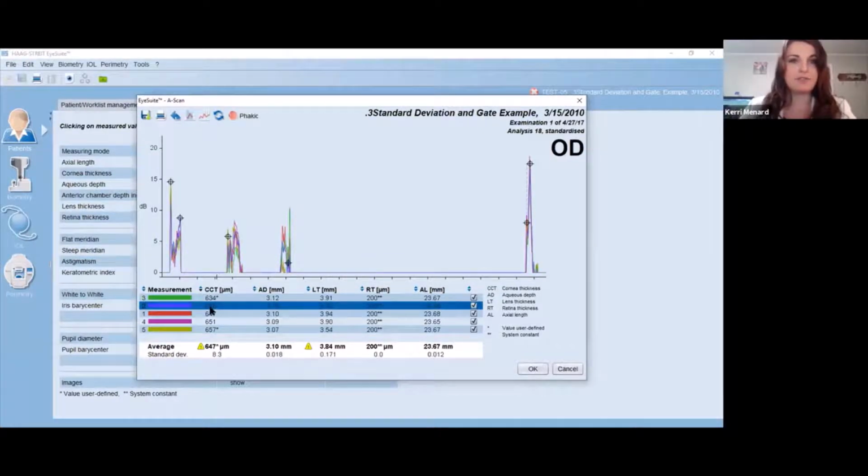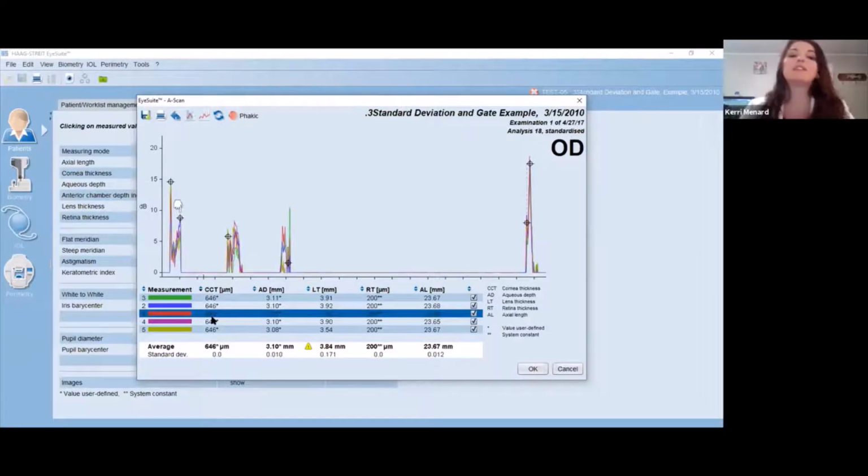The other way you can resolve your caution is hovering the crosshair of your cursor over the crosshair of the posterior corneal gate, and then click and then drop to reconfirm the placement that that is the posterior corneal spike. So we can fix that one of two ways.